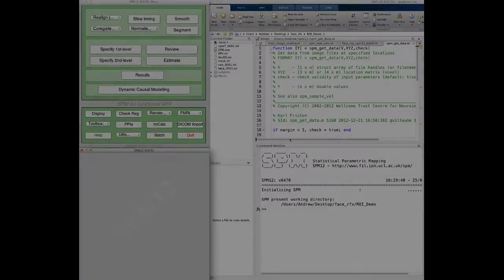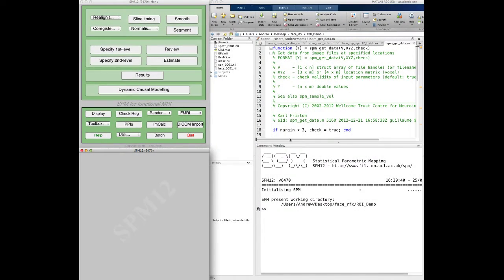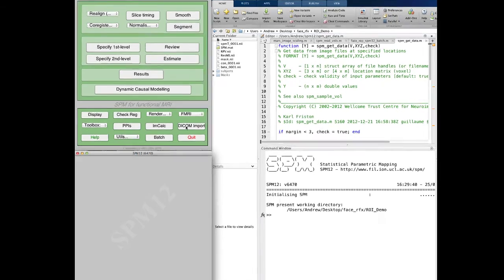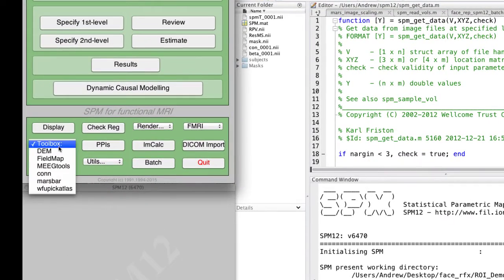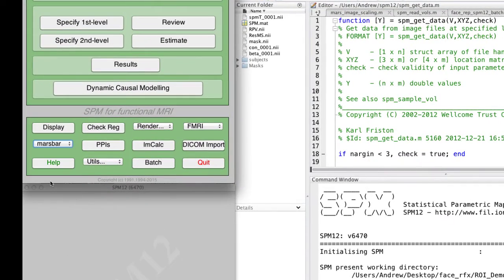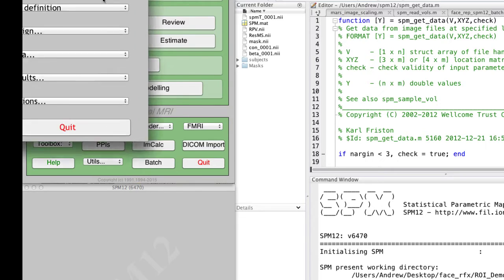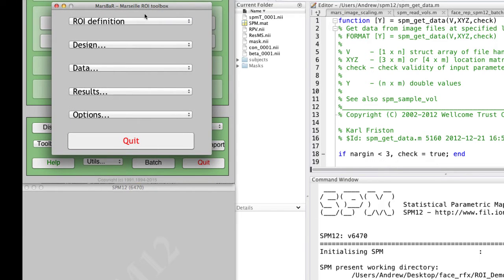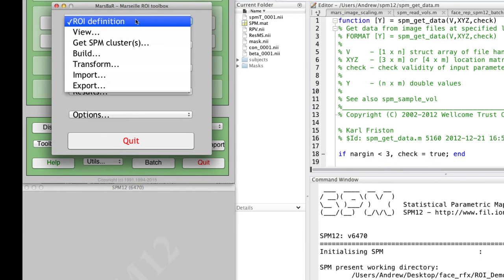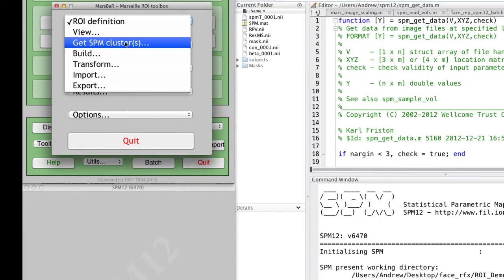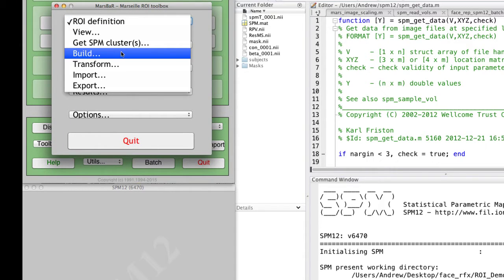Let's take a look at how to do a spherical ROI analysis in SPM using the toolbox MarsBar. Go ahead and select MarsBar if you have it installed, and then select ROI definition and build from the options.